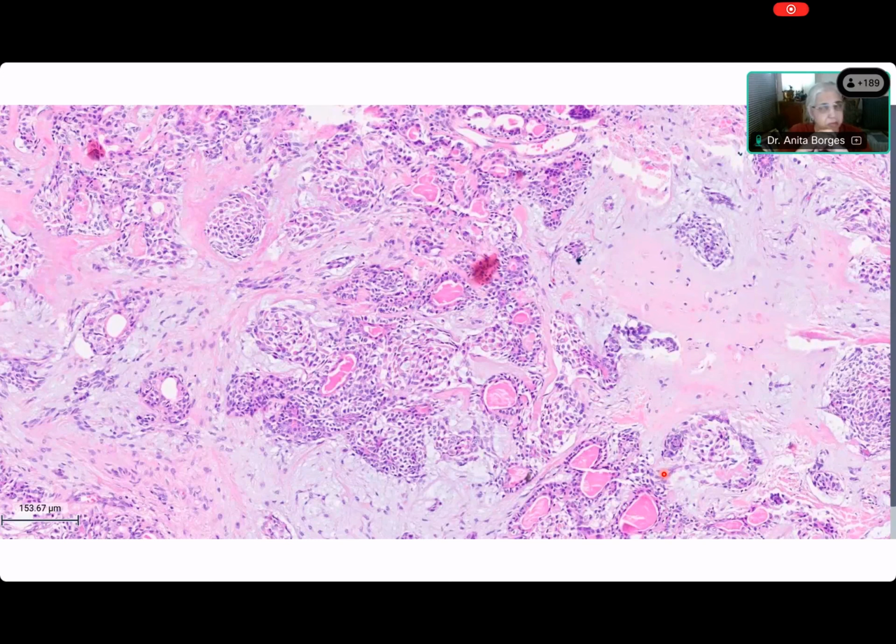Madhu? Ma'am, there is a luminal and abluminal differentiation. You can see that there are lumina. The lumina here, as she described, have got some secretions. But clearly you've got luminal and you've got abluminal differentiation. Did you see that, Shivani? Yes, ma'am. That's the feature of note. Any other feature of note?